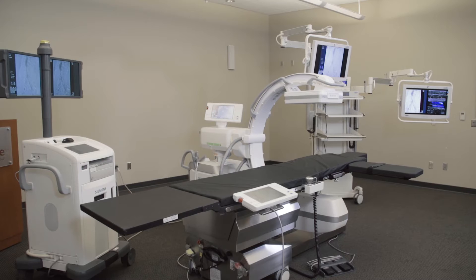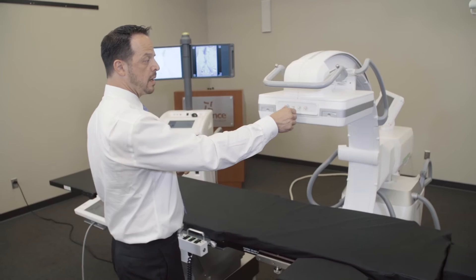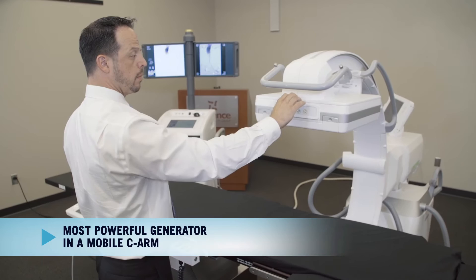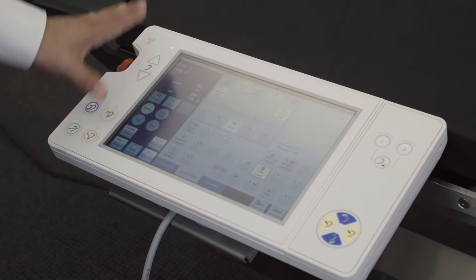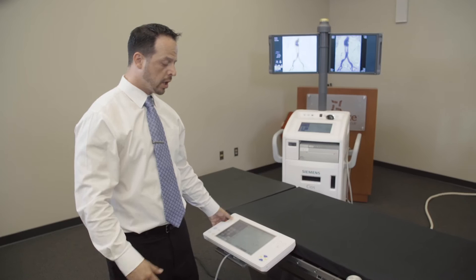Over here is our CO-SALFA flat panel C-Arm. It's a 12x12 detector with a 25kW generator. The surgeon has full capability of being able to manually maneuver and articulate the C-Arm at the bedside, as well as via the control panel that is exactly the same as the one on the C-Arm. So the surgeon can go ahead and maneuver the C-Arm up or down with the motor.